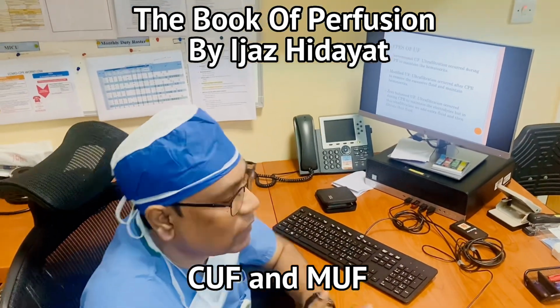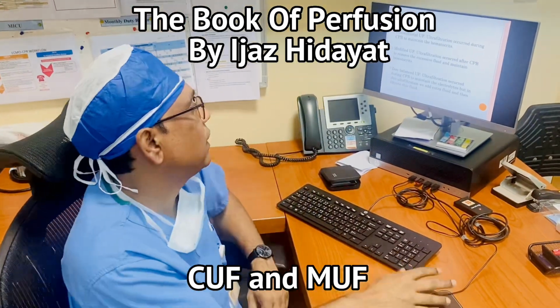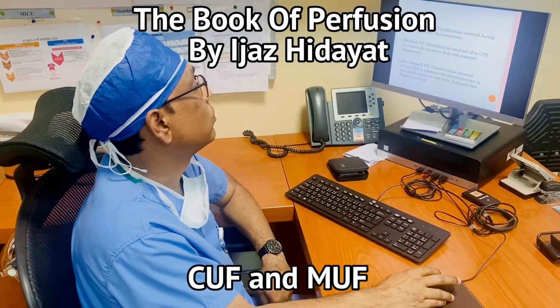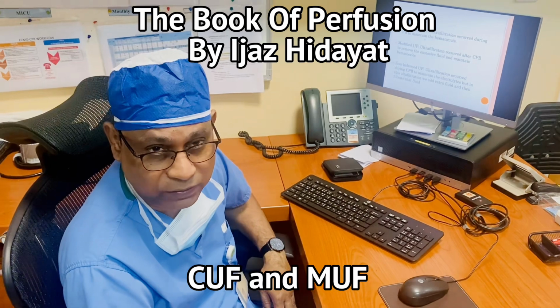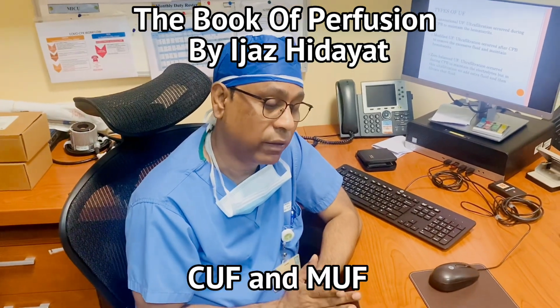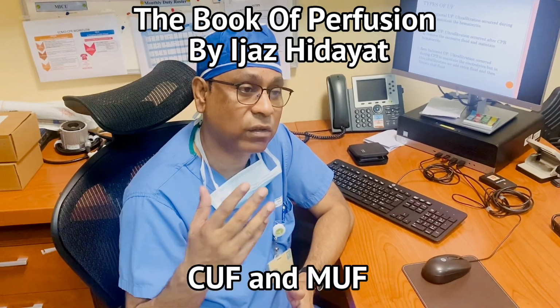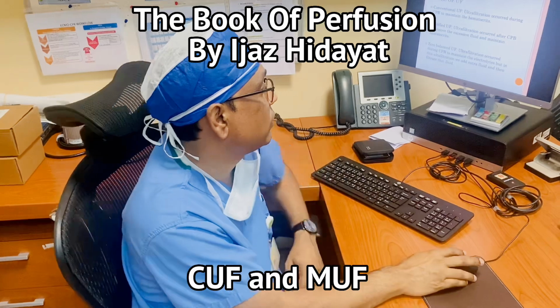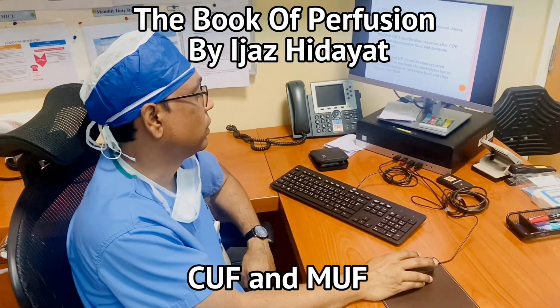So once again, conventional ultrafiltration occurs during bypass to maintain the hematocrit. By doing ultrafiltration during bypass, we increase your viscosity and your hemoglobin by removing water, which maintains your hematocrit during the bypass.